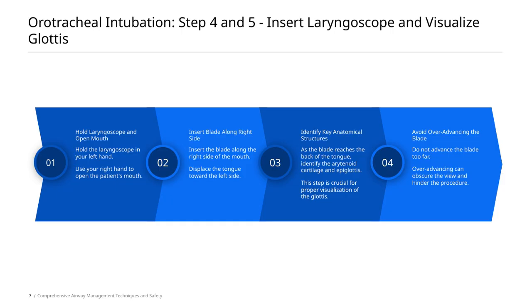Be cautious not to advance the blade too far. Over-inserting can obscure your view and make the procedure more difficult. Proper technique here sets the foundation for a successful intubation, so focus on control, visualization, and anatomical awareness.